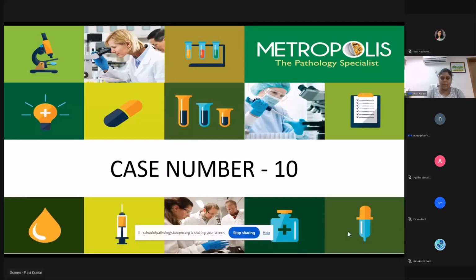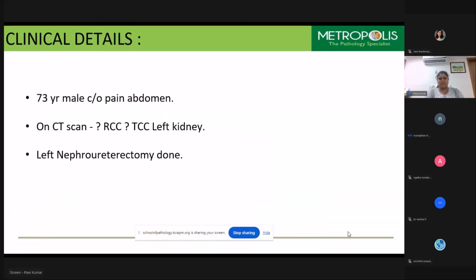Am I audible? Yes, ma'am. Okay. So we'll start. You have already told the case history, which is a 73-year-old male with a left renal mass.